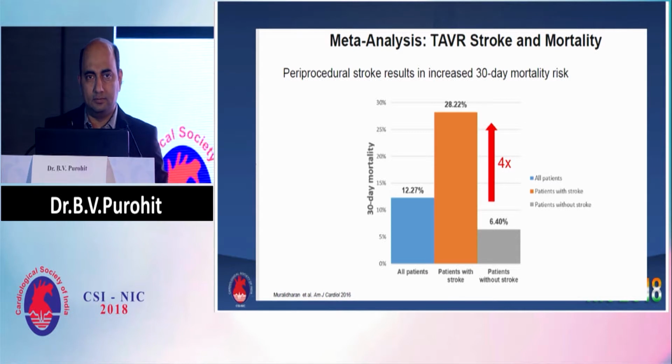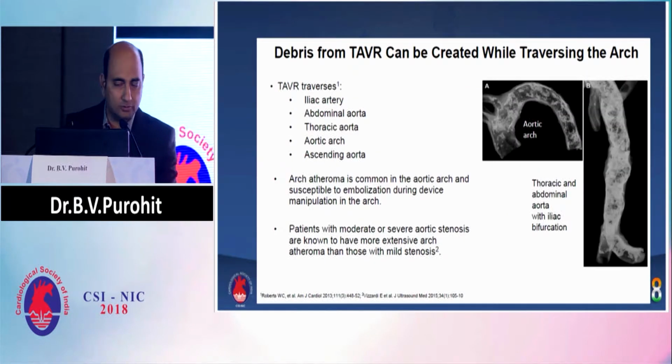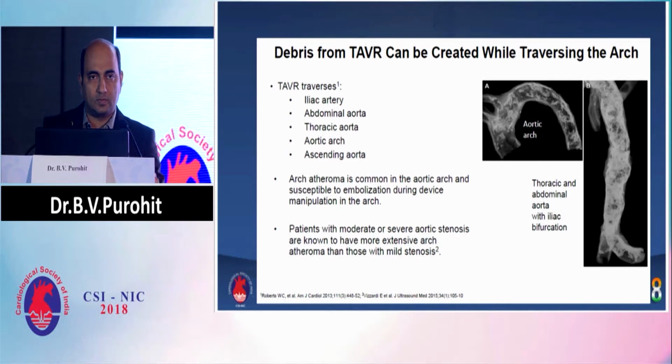Why does it happen? We all feel that it is probably because we are dilating a balloon in a highly calcified artery, and probably the debris is going out. But that is just one part of it. It is not that only the material is coming from the valve.